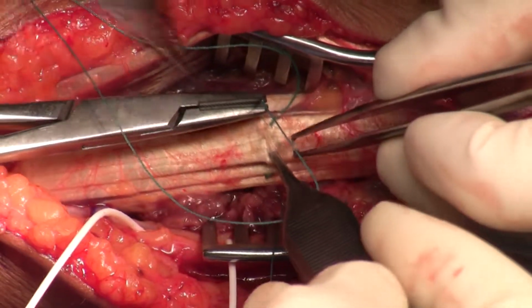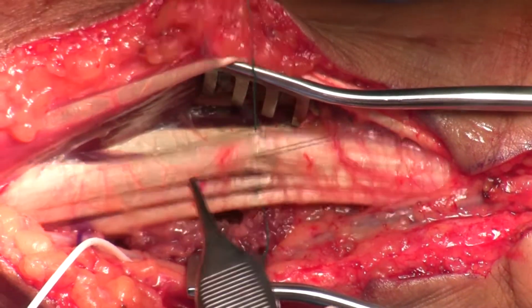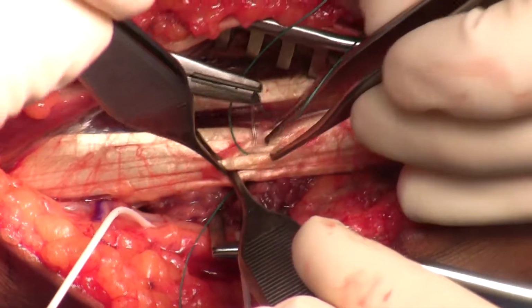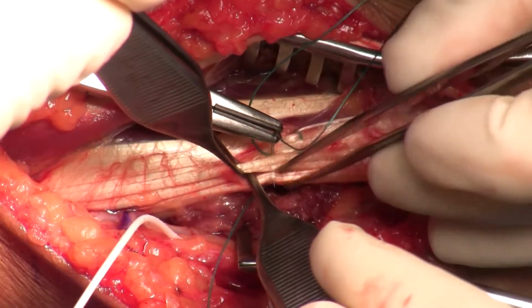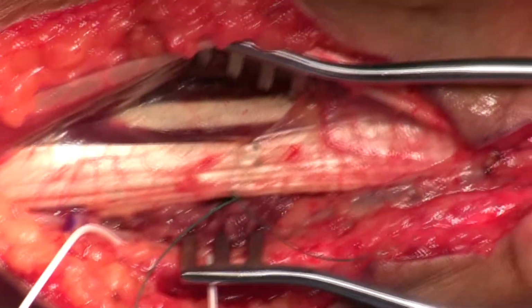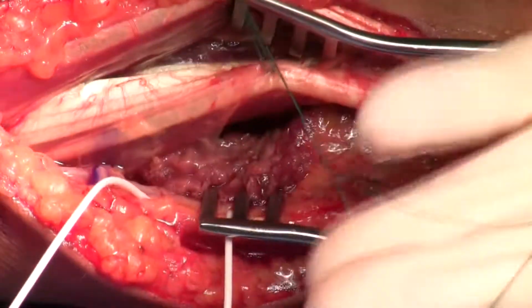Now you can check that you've got an appropriate amount of tension by looking at the cascade of the hand, with the cascade of the index and then the middle, ring and small finger. And you can see just that amount of difference there, that extra little bit of pull, and the first suturing that you do really sets up your tension. I'll do this back and forth suturing 3 or 4 times, but it's this first one, of course, that's going to set the tension. Nice. You can see how that's just snugging that in a little bit.